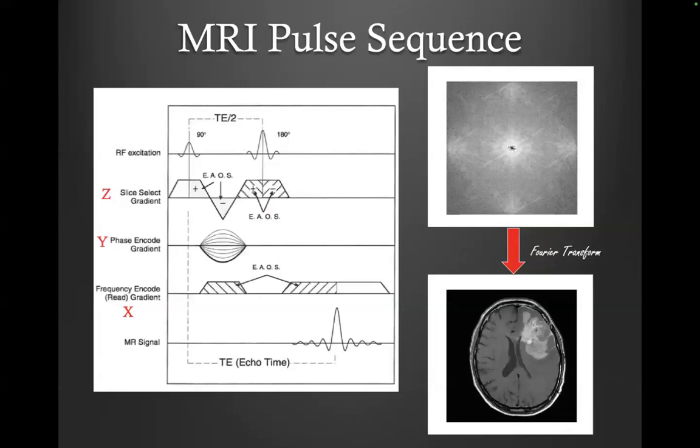But here I just want to show you an example of an MRI pulse sequence, like any imaging sequence. And this is just within one repetition time. You actually have these events played out over time for 2 minutes, 3 minutes, or 6 minutes, 10 minutes for each round.